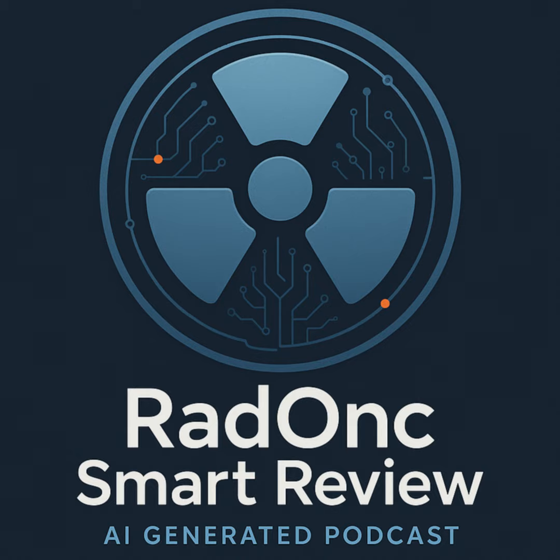Perfect. Now the third control, filtration. We know Bremsstrahlung makes a lot of low-energy photons. You call them soft X-rays. What's the issue with those again? The problem is, these low-energy photons just don't have enough energy to penetrate through the patient effectively to reach the image detector. They can't really contribute to forming the image.